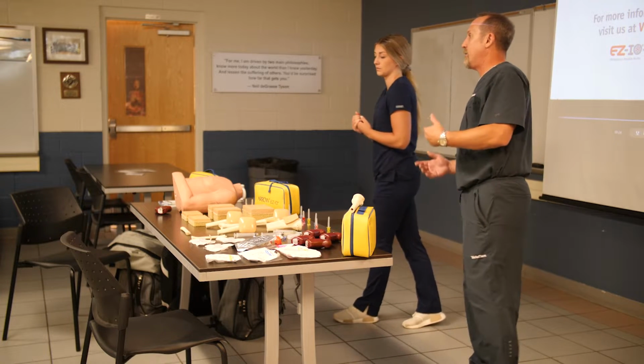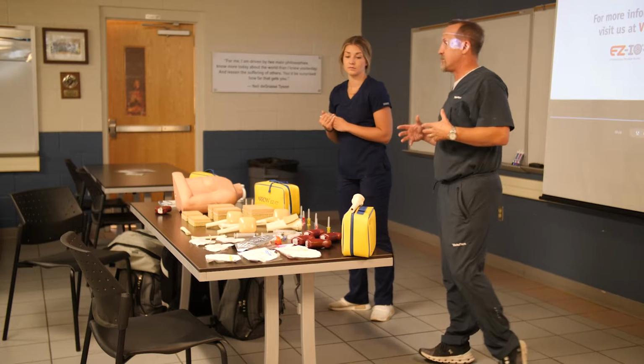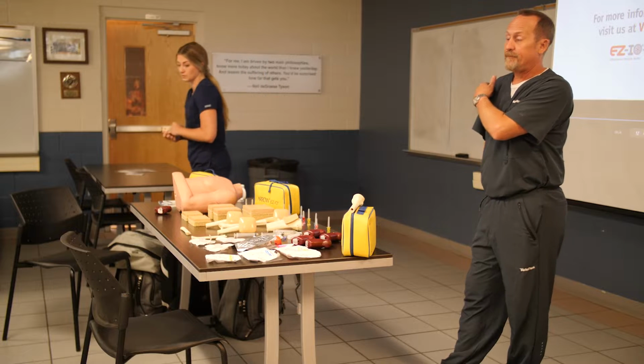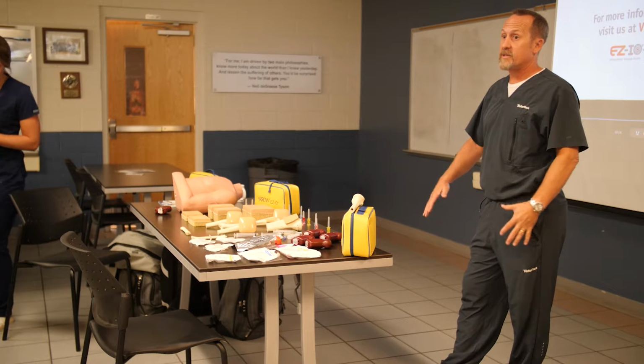Okay. Now, one thing I want to talk about too is if you guys are using a Lucas machine. After we've positioned the arm and we've put the needle in, it's okay for the arms to move.